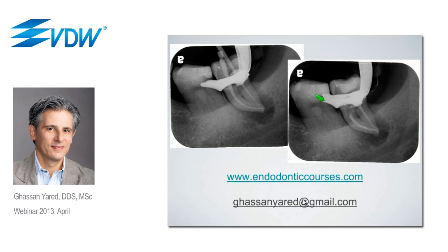So for this case, again, the canal preparation was started with the R25. The R25 was taken to the estimated length minus 4 or 5 millimeters. A hand file was used in the canal. Fortunately for me, I did not have to pre-curve it. It went straight to the working length. I knew then that in this case I could use the Reciproc to the working length without any issues. And with this, I finish my presentation.